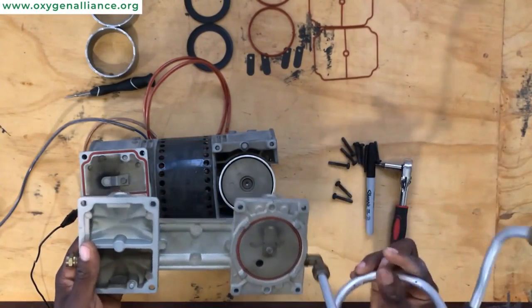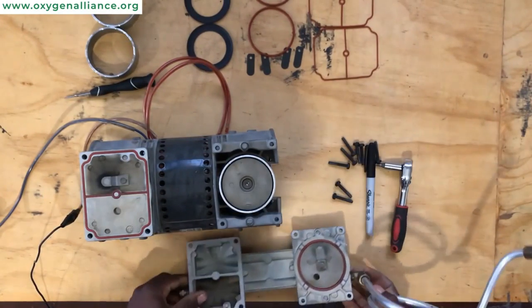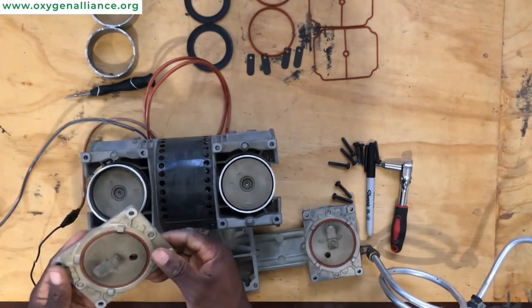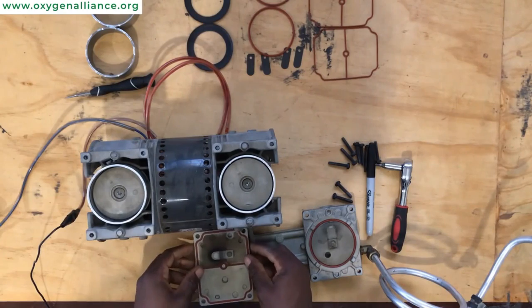Depending on how long the compressor has been running, sometimes the valve plate can stick to the top of the sleeve, but you can just pull that out.